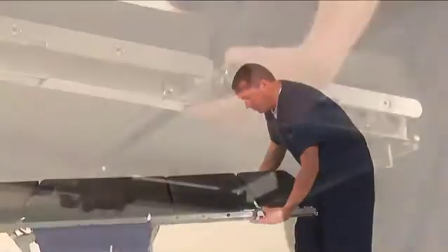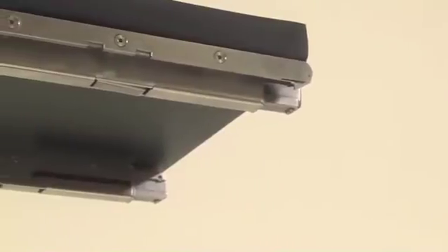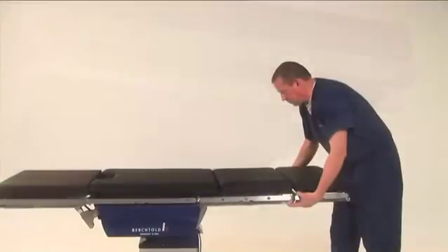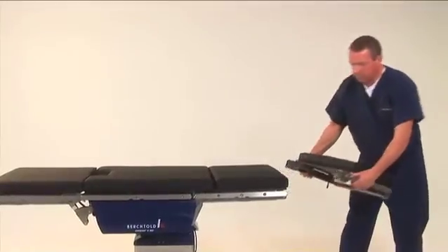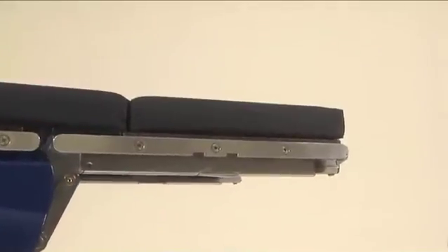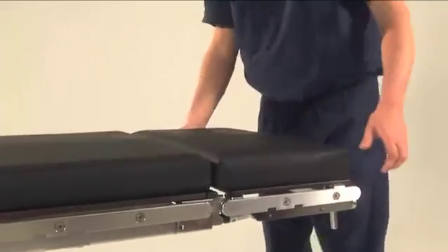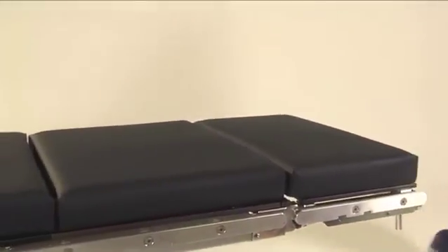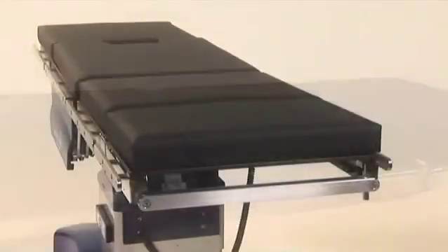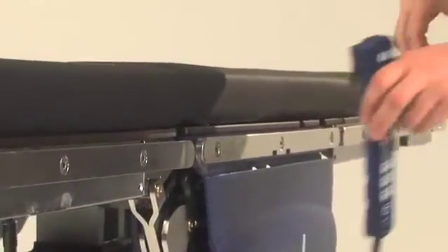To remove the head section, press the lock release buttons underneath the table at the juncture of the head and back section, and pull the head section away from the table. To return the head section to the table, simply slide the attachment rails back into place until you hear the locks engage. The head section is now secured. A side rail runs across the head section for easy access to the hand pendant or for accessory clamps.